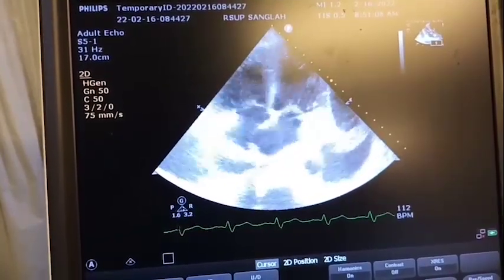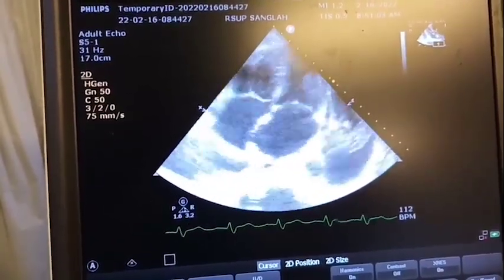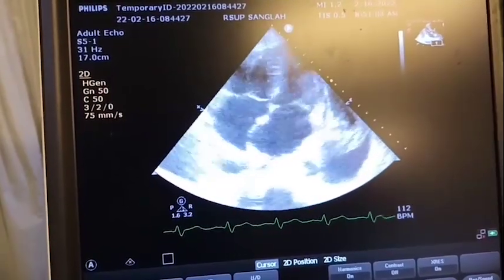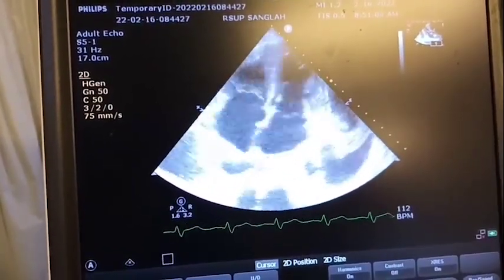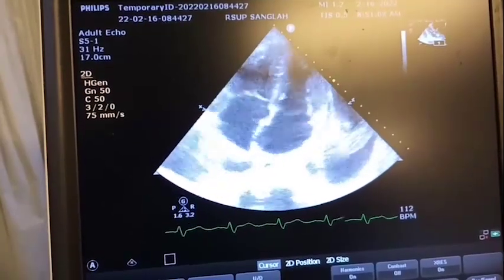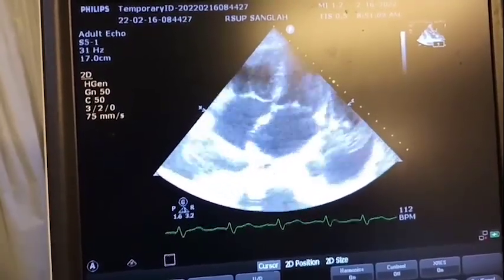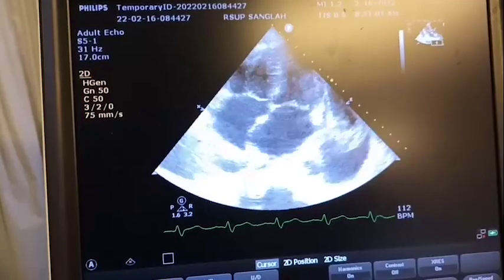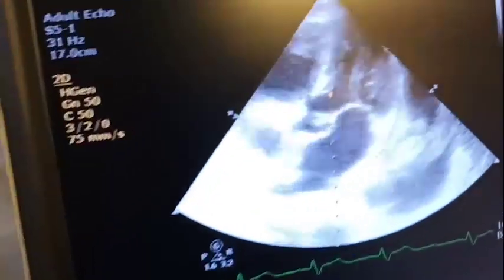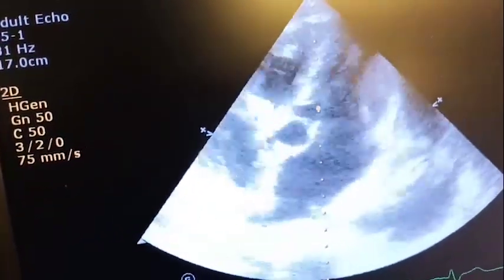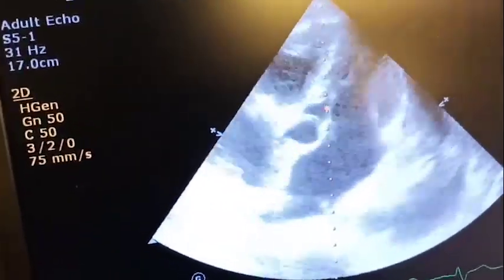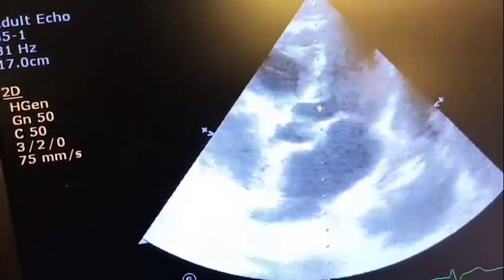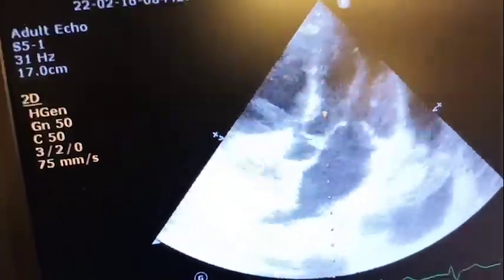We will see the left atrium, left ventricle, right atrium, right ventricle, interventricular septum, interatrial septum, mitral and tricuspid valve. The next step is tilting the probe to get the apical five-chamber view, where we will see the aortic valve, aortic root, and LVOT.